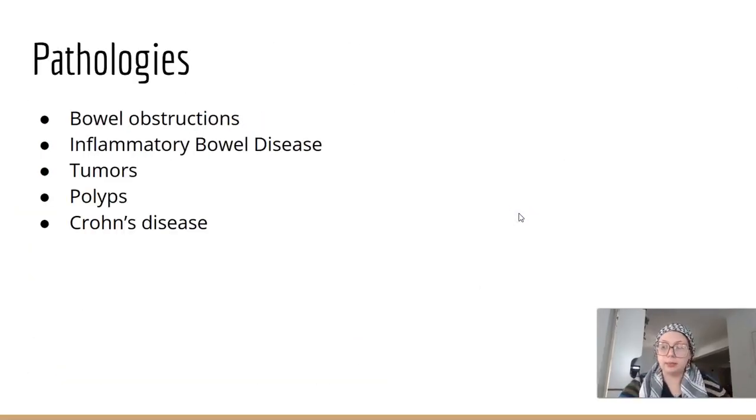Some pathologies that can be found on a single contrast barium enema. Like I said before, bowel obstructions and inflammatory bowel disease, tumors, polyps, and Crohn's disease.